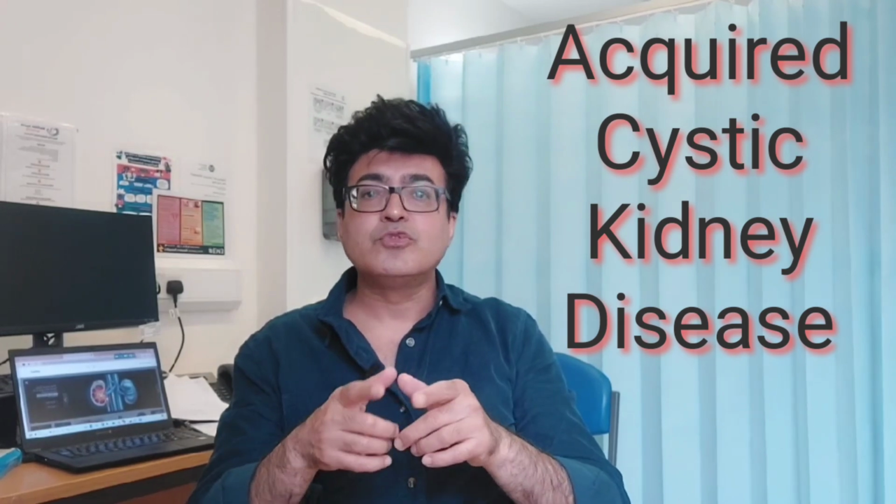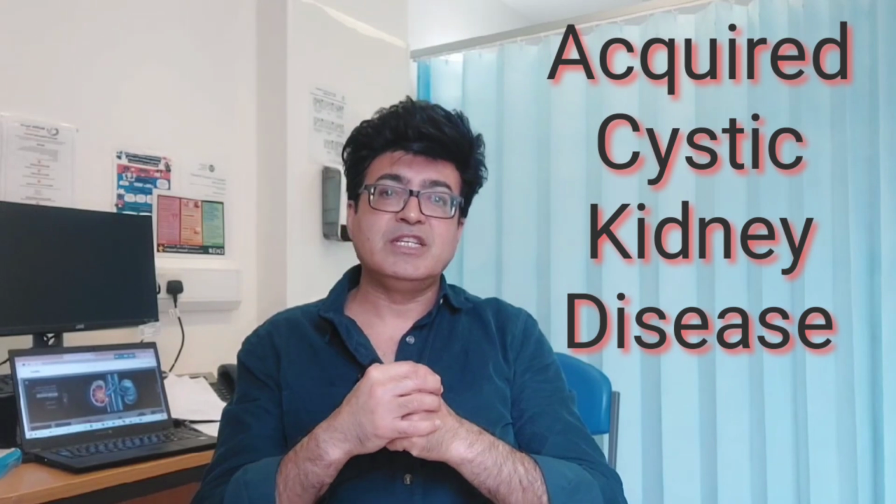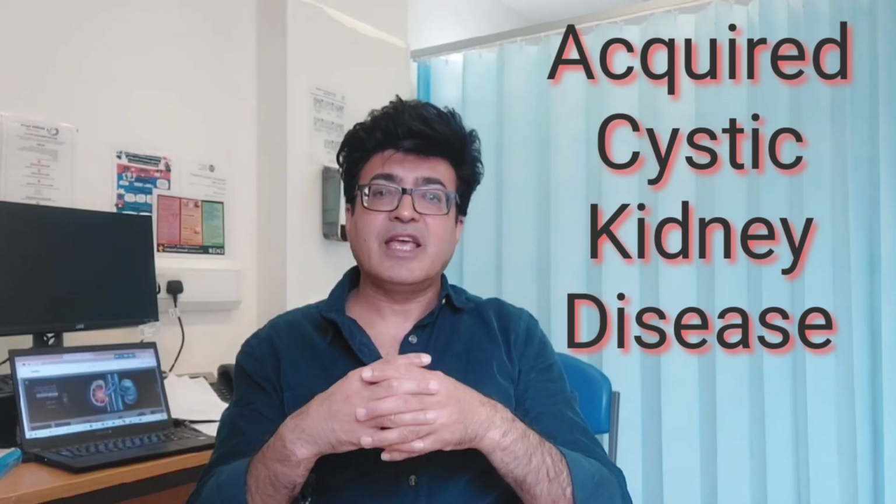The one hallmark is that these cysts are prone to develop renal cell carcinoma. So keep an eye on that. Those who have been through dialysis, you should regularly monitor their kidneys for the development of any cyst. So this is called acquired renal cystic disease, as it is acquired.